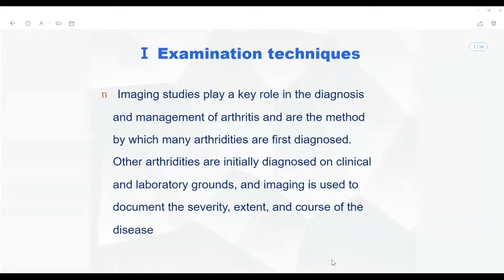Most of the time in this chapter, we are going to talk about the primary arthritis conditions, which show up as a primary cause inside the musculoskeletal system in origin. That's how we are going to learn about this. For such conditions, joint radiography plays a very important role. The first thing we try to look for in a joint radiograph is arthritis.